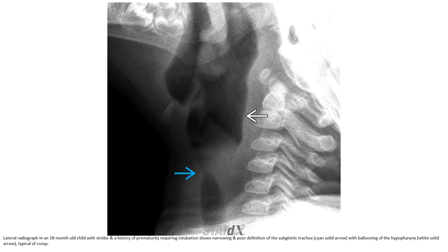Another case: lateral radiograph in an 18-month-old child with stridor and a history of prematurity requiring intubation. Narrowing and poor definition of the subglottic trachea is noted, with ballooning of the hypopharynx.